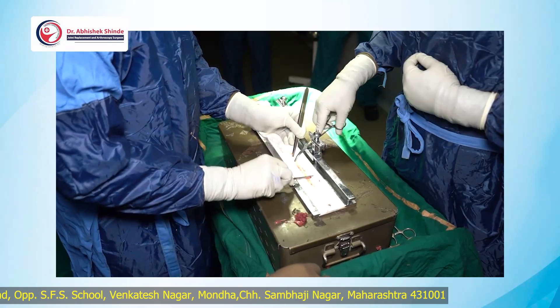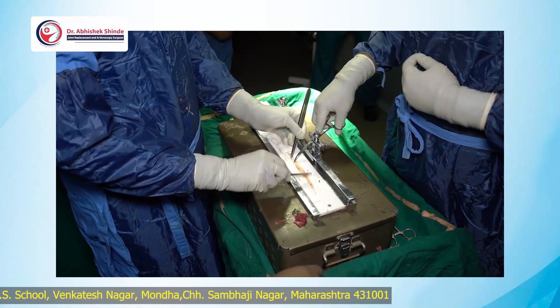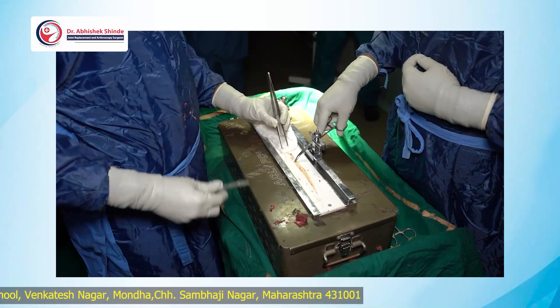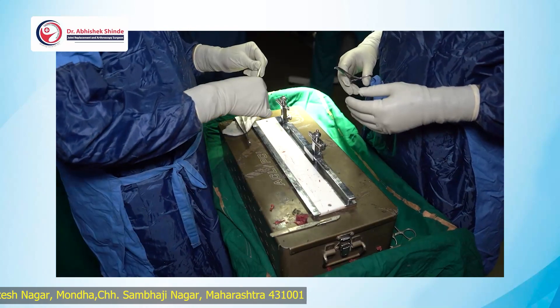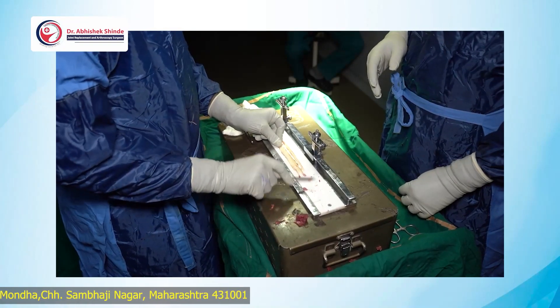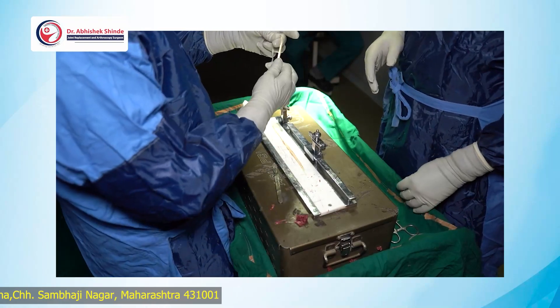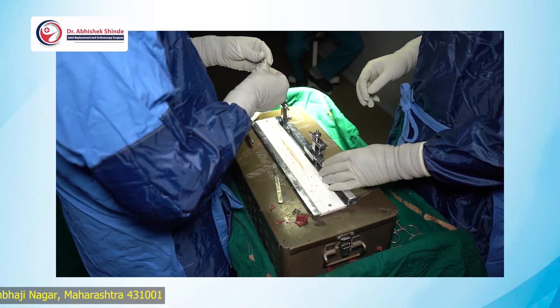For the graft soakage, I use saline and put vancomycin in powder form, so that the vancomycin-soaked graft — it has been proven even in the literature — gives less chance of post-operative infection. Once you have measured the graft, you can prepare it on this board.